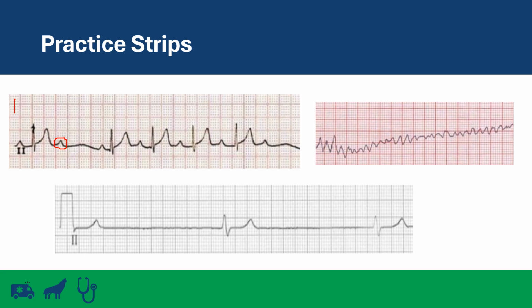I recommend always look at the first and the last PR interval. So if I compare these two, this PR interval is obviously longer before I get to this naked P wave. So I have a lengthening PR interval with a dropped P wave with no QRS. So this is a second degree type 1 heart block.